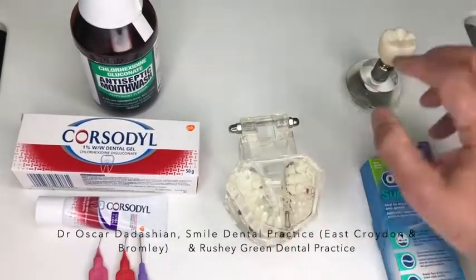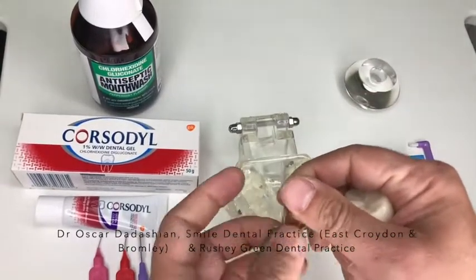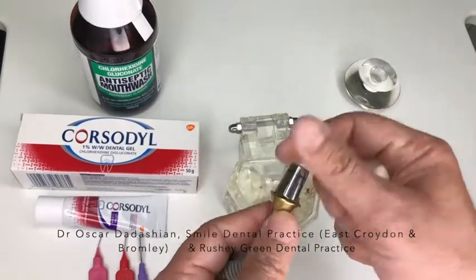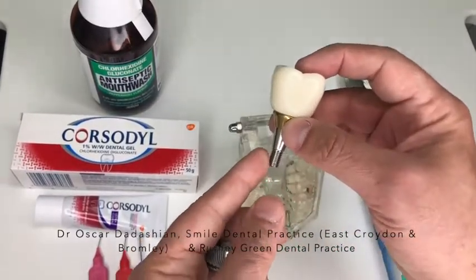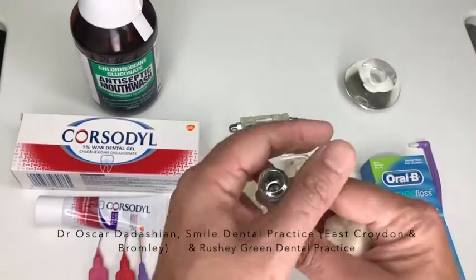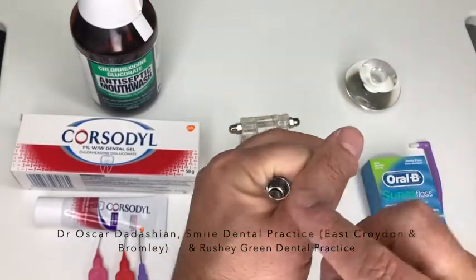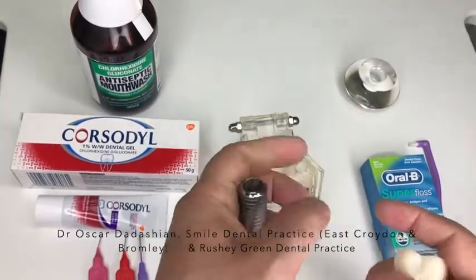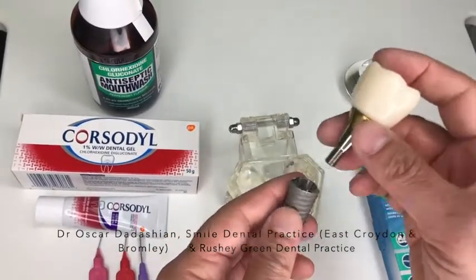And if the whole thing comes out, which again, often happens, you end up having the crown coming out with the abutment and the screw part, and the implant still stays within your gum. If that happens, you don't worry about that. Try to keep that area very nice and clean, and as soon as you can come to the dentist, we will fix that for you.